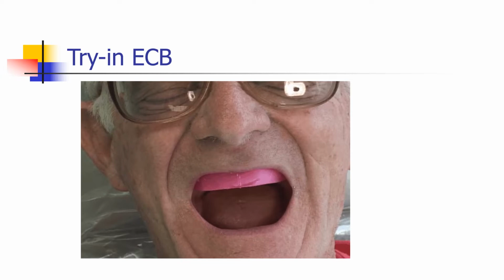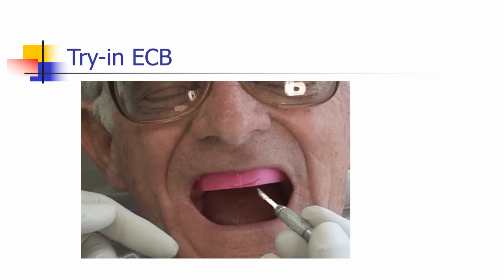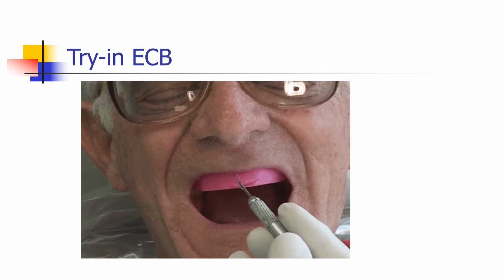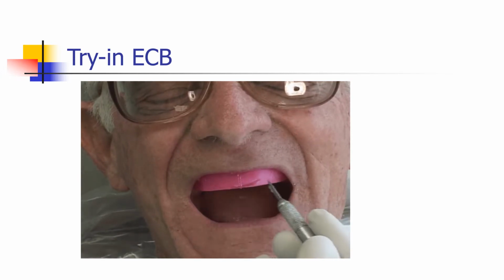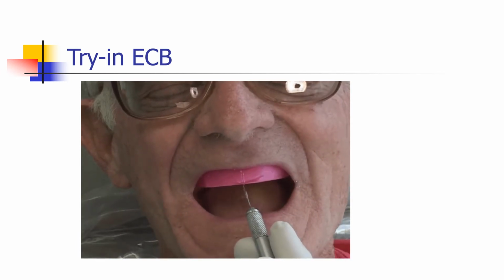And once we get teeth set, it's easier to tell the midline, but it's nice to be able to get that right in the proper place originally. What we want to do is, in a smile, we want that midline to balance the teeth on both sides and somewhat fall in the midline of his face.